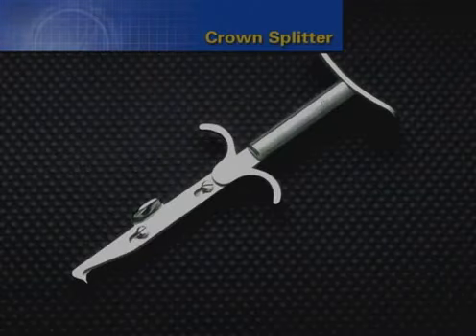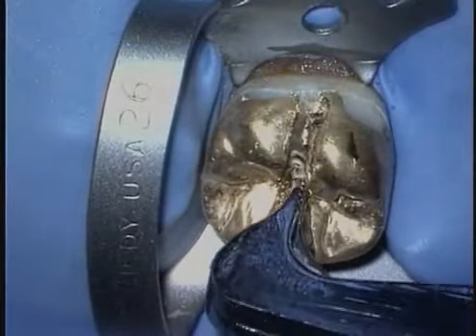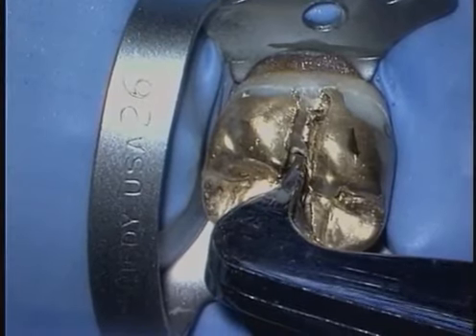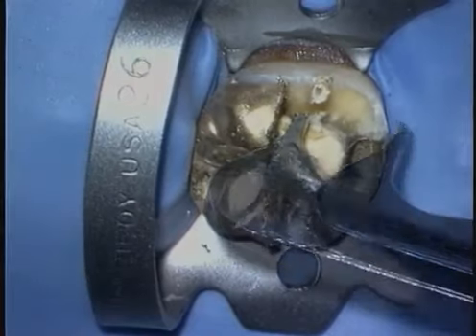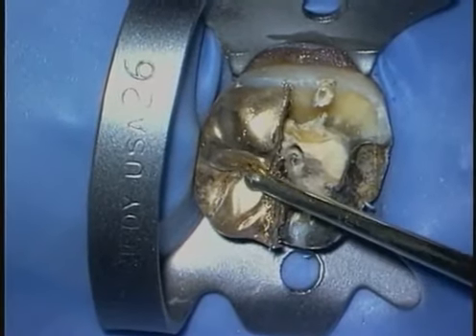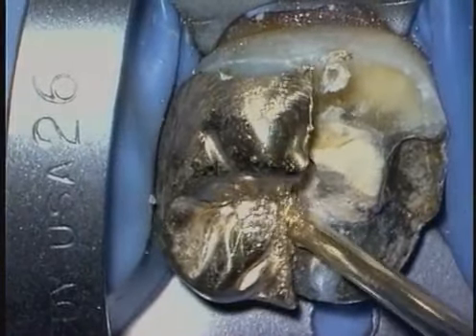The crown splitter has a wedging device at its working end that, when activated, will effectively dislodge most restorative segments. Carefully insert the instrument and with handle pressure, you can generate the dislodgement force. Typically, one half will stay, so ultrasonic energy is very useful to vibrate and dislodge that piece.